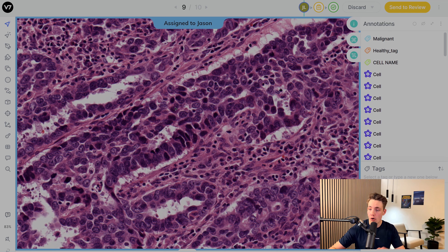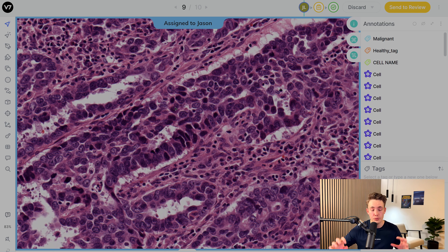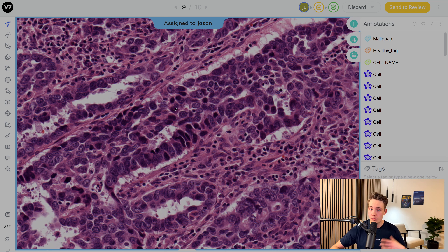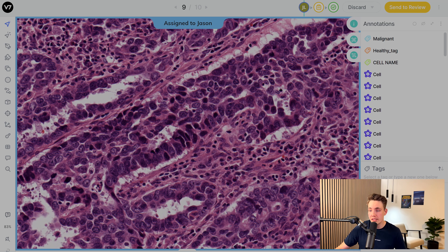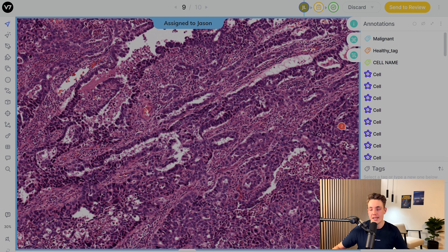If we were to manually annotate all the cells in the image it would take a lot of time. But we can start with some initial labeling, train our own model for segmenting these cells or doing object detection. We can also assign labels and attributes to all the instances we're going to label — for example, just a 'cell' class. Then we can train a model. I'm going to show you how to set up the workflow with consensus and review stages to ensure the best label data possible, because these are really life-changing models solving healthcare problems. We can auto-annotate cells, train a model, and then use auto-labeling to label all the cells in our WSI files.